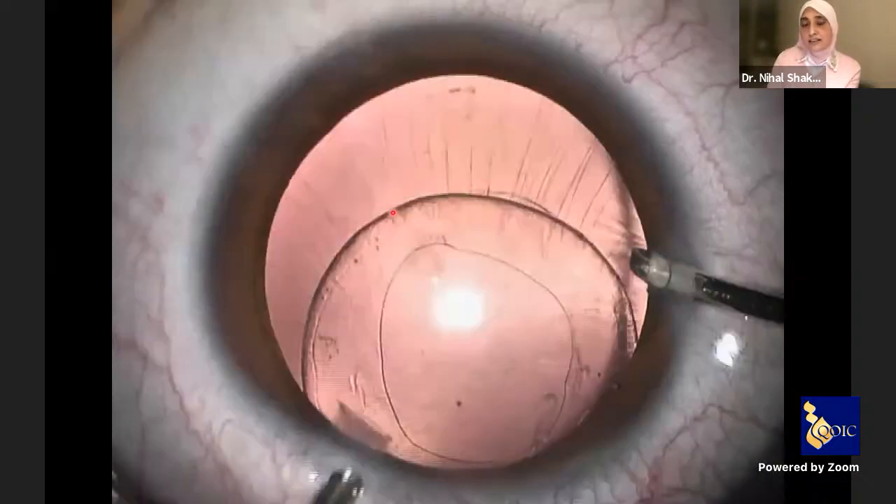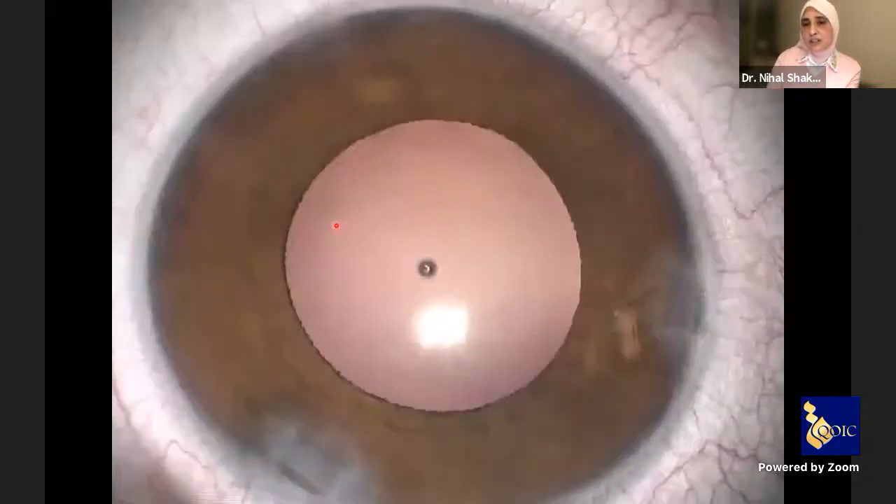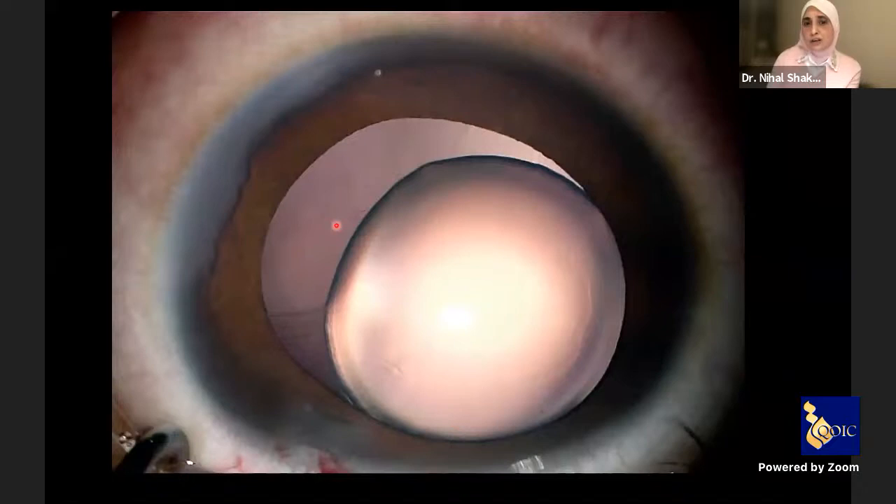Look here — after irrigation aspiration, the zonules are still intact, indicating that there was no movement during irrigation aspiration and vitreous didn't prolapse during irrigation aspiration. This lowered the incidence of retinal detachment in the future, and you can easily go in and excise the capsular bag with the cutter. Here is the conclusion of surgery.